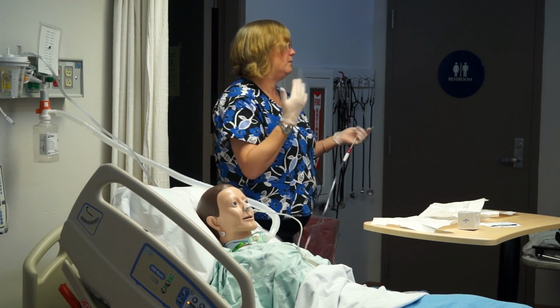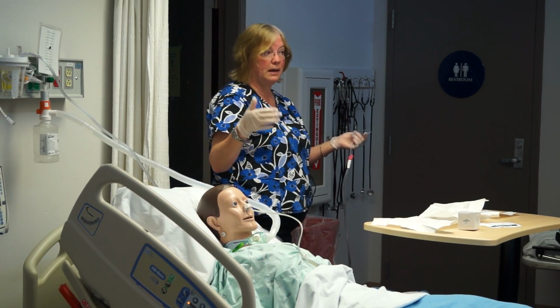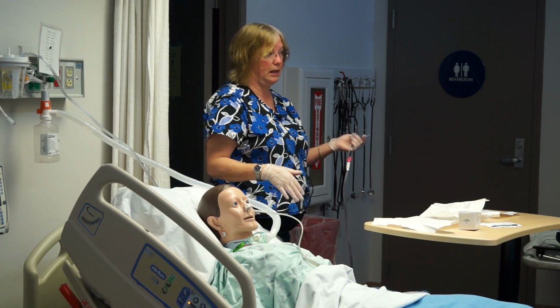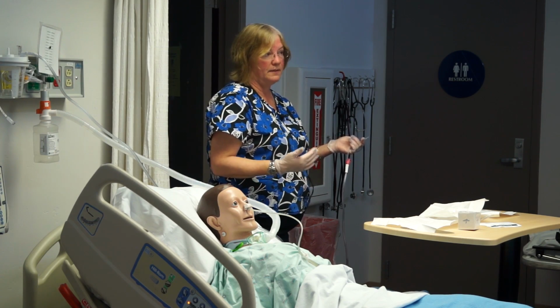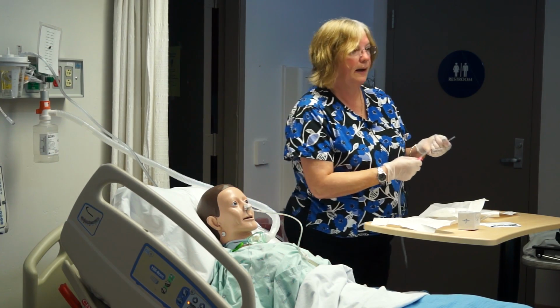If I have a patient that I'm getting tons of secretions out of, I may take 2 to 3 minutes in between and resuction my patient again, giving them a chance to get their sats up a little bit, and then I may go down one more time. And that's going to be it, guys.